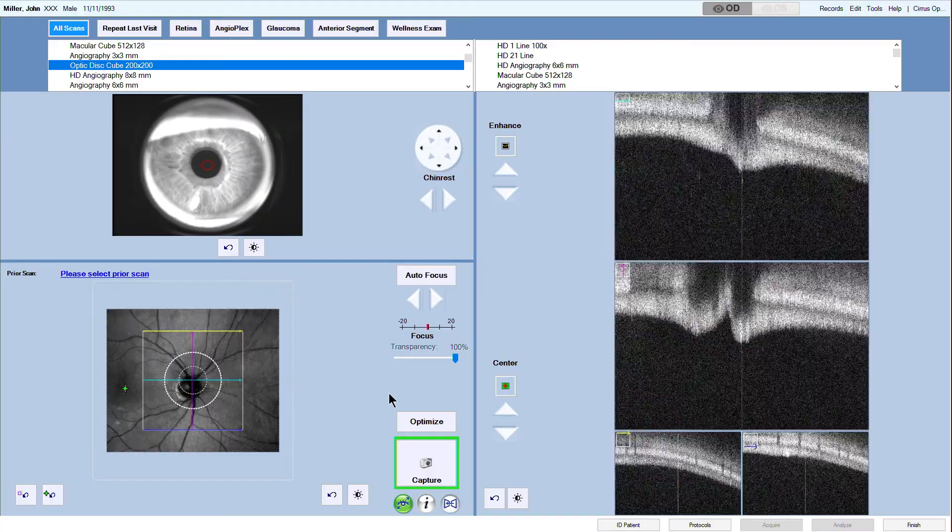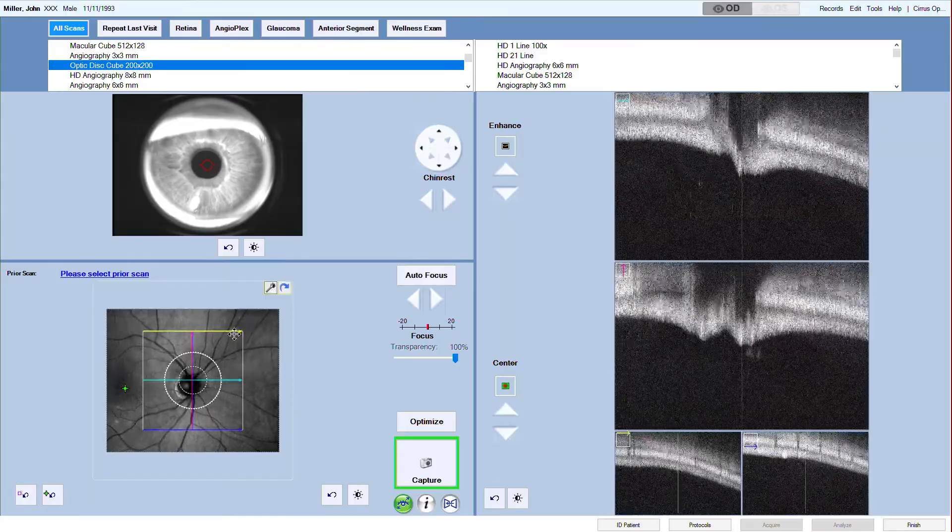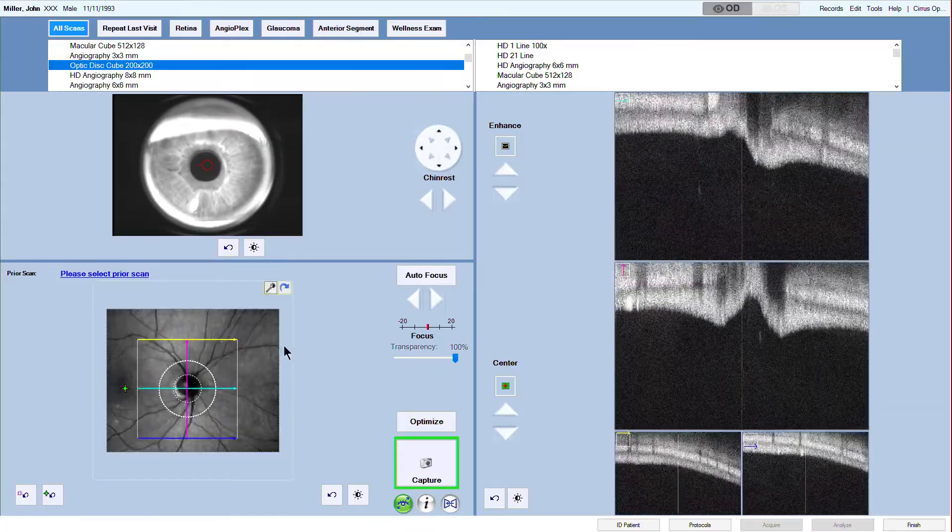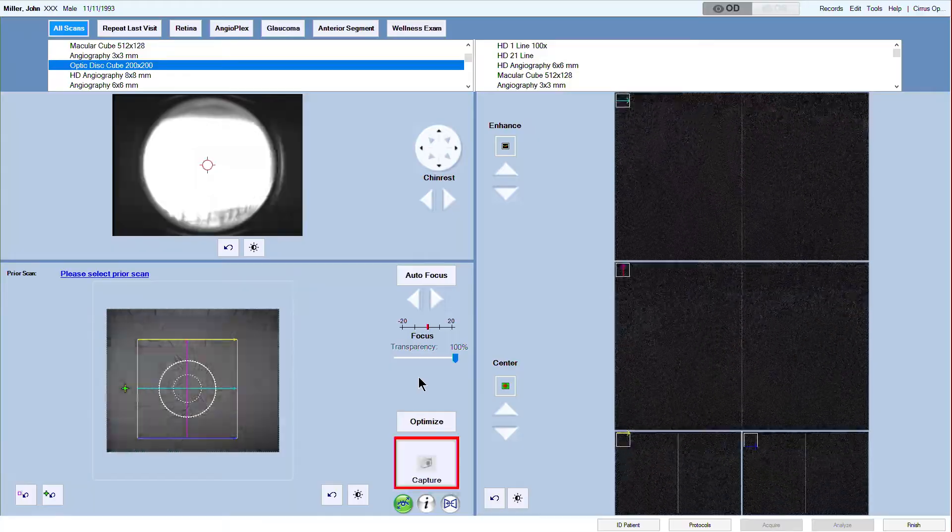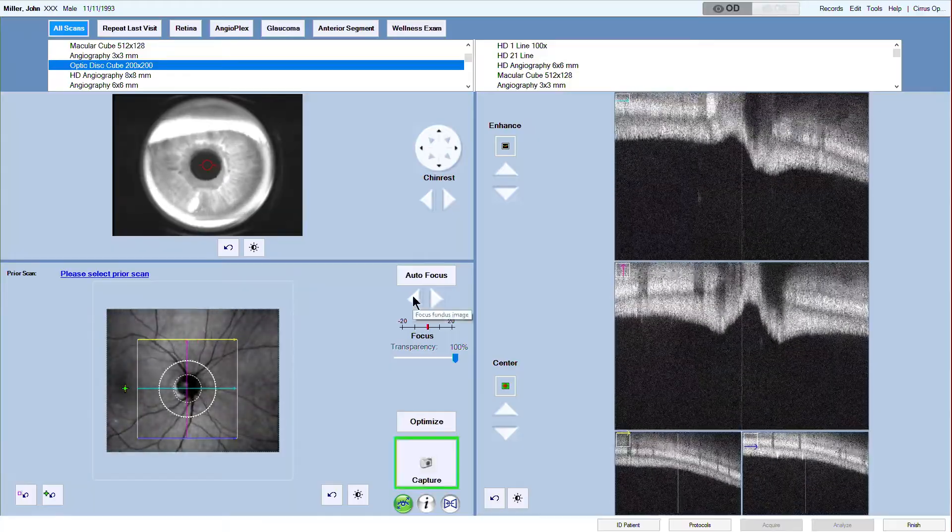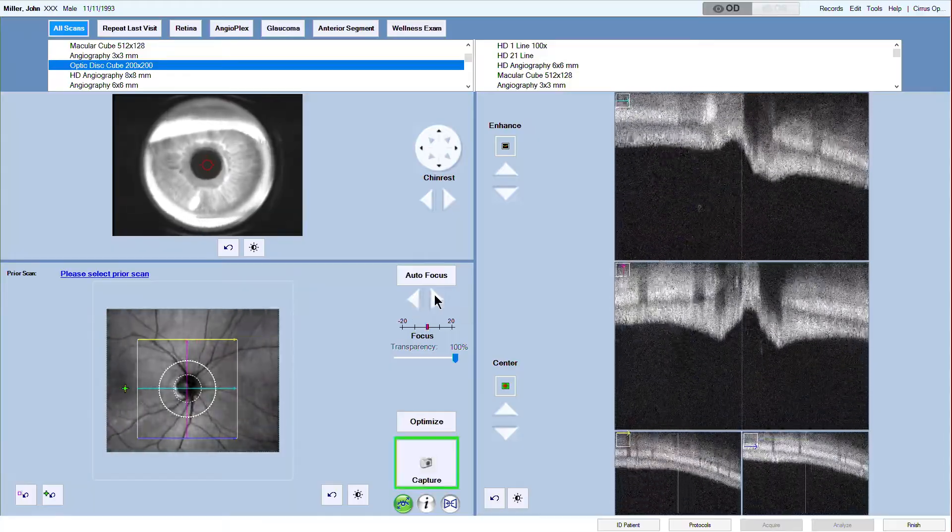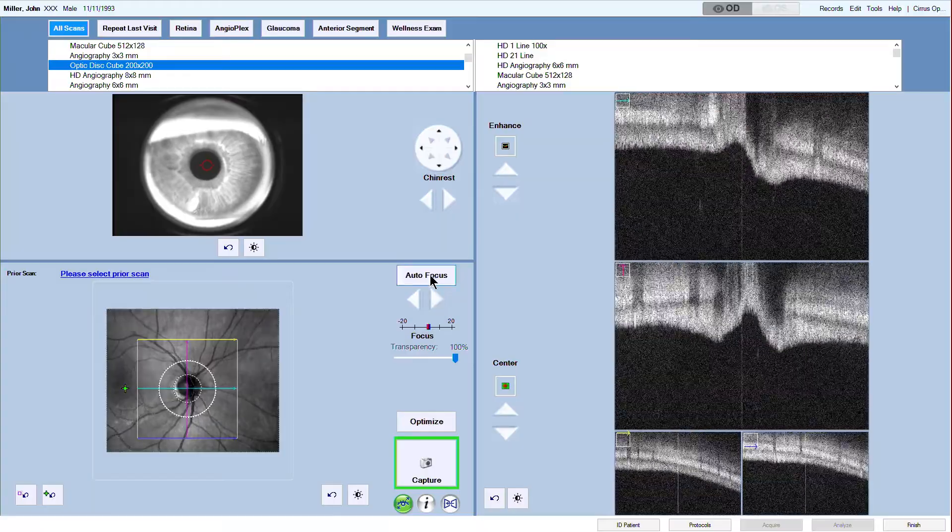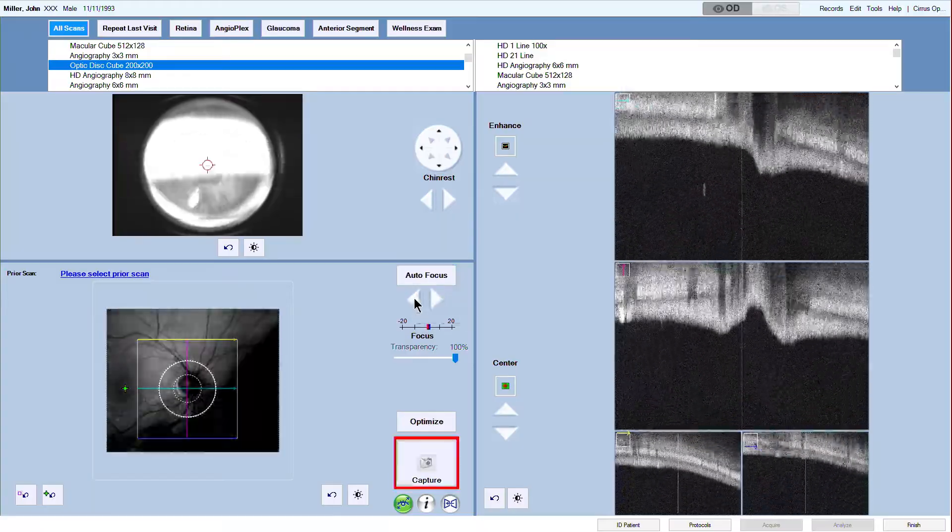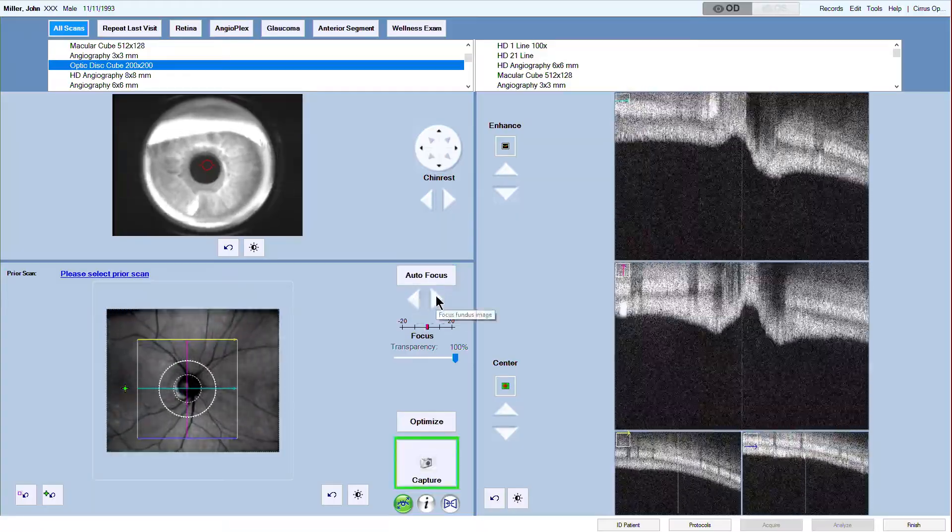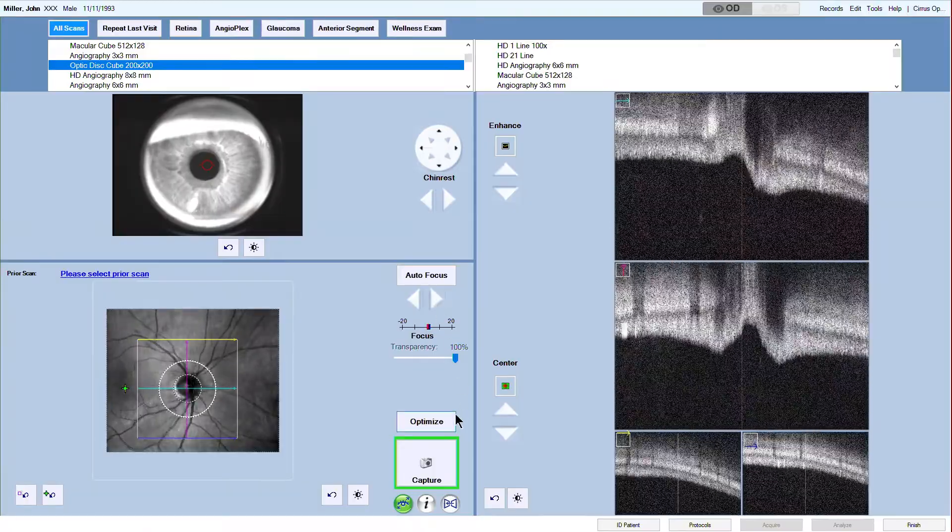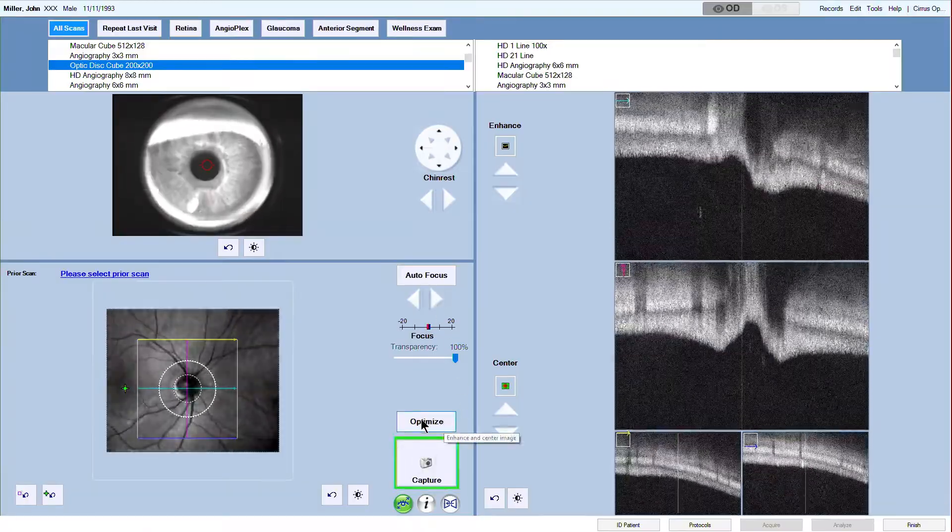Now the next step. The fundus viewport displays the live fundus image, the scan pattern, and the fixation target. After aligning the iris, focus the retina next. You can use the autofocus button or adjust manually. The fundus should be sharp and clear and well illuminated.